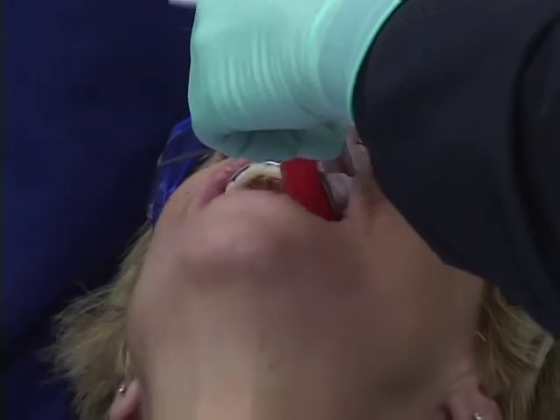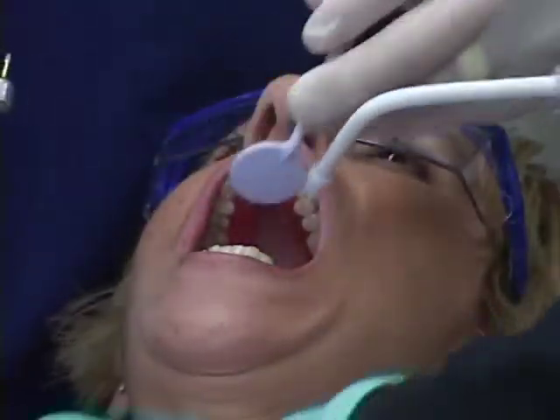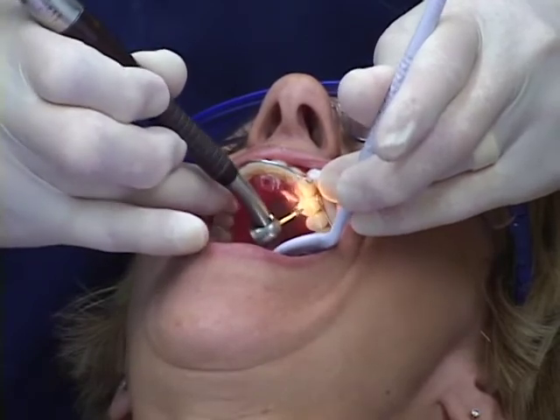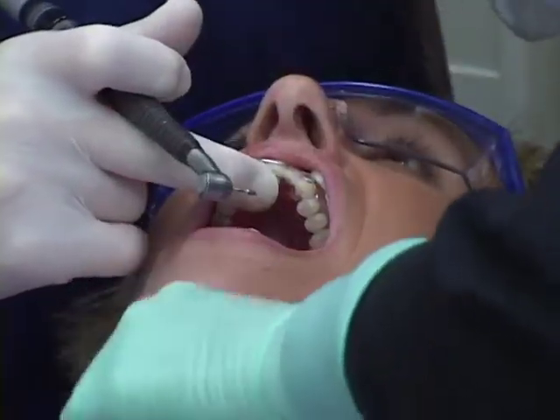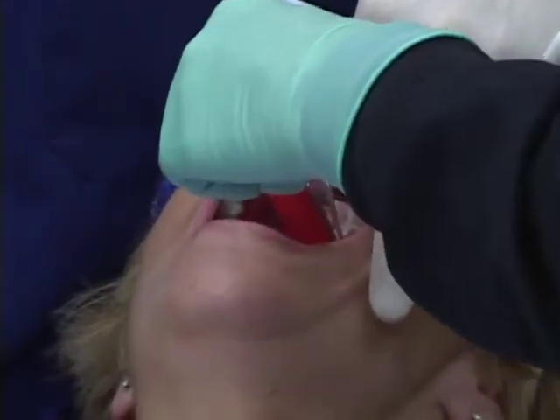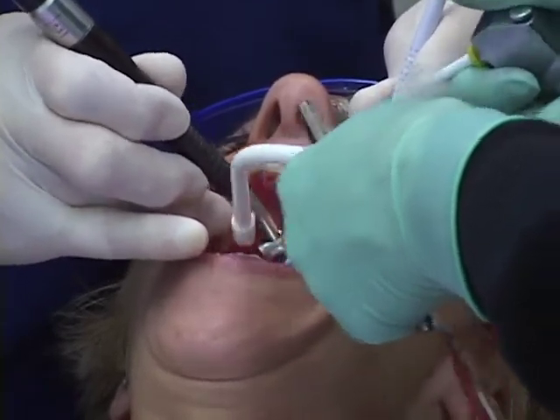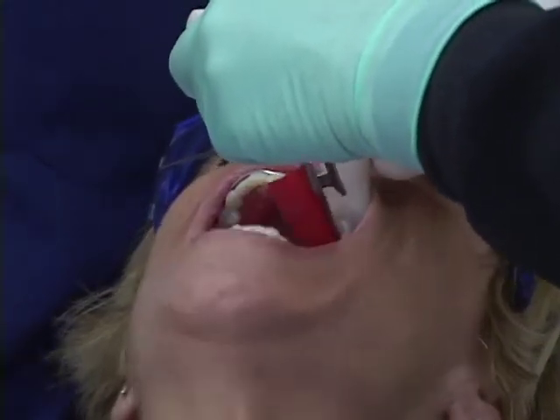Tap. Okay. Again, we're using the Parkell. What's the name of the film? It's a film. Parkell brand, 16 micron. No, I'm sorry, I'm using Bausch film. It is the red and the black, 12 microns. Hanel film, thank you. It is Parkell, right? Yeah. We just recently changed it. Good. We're off there now.